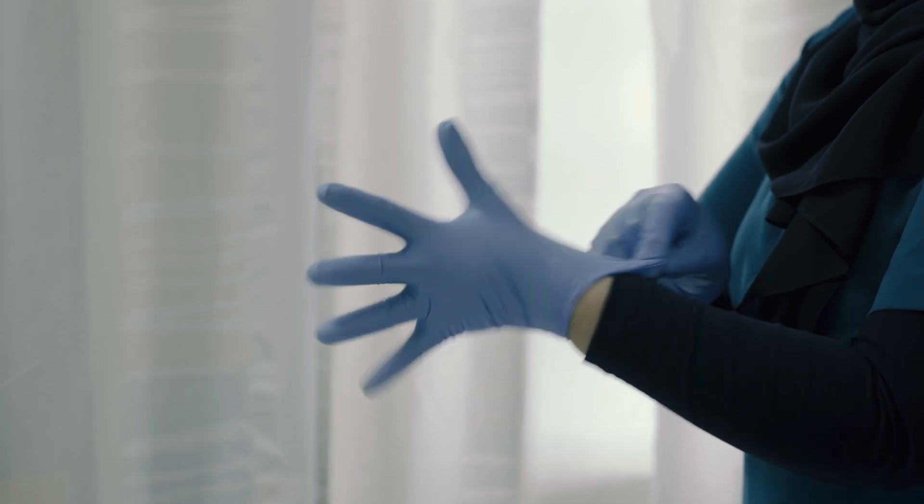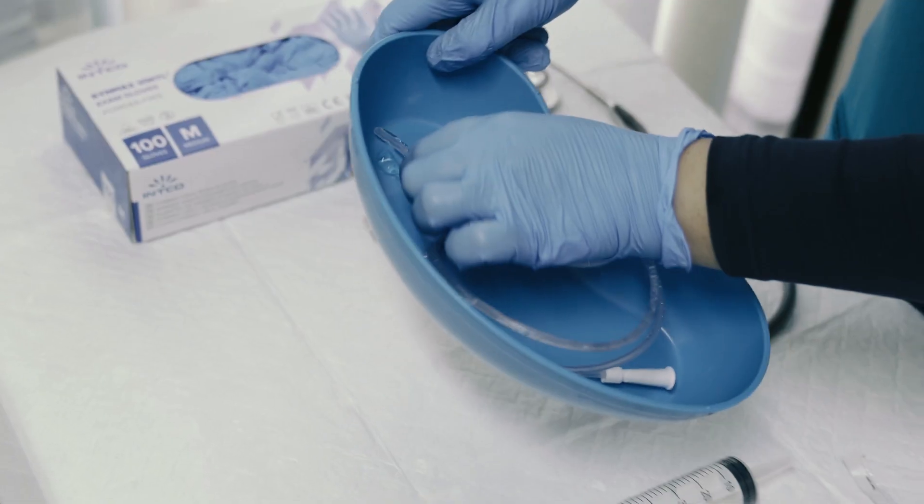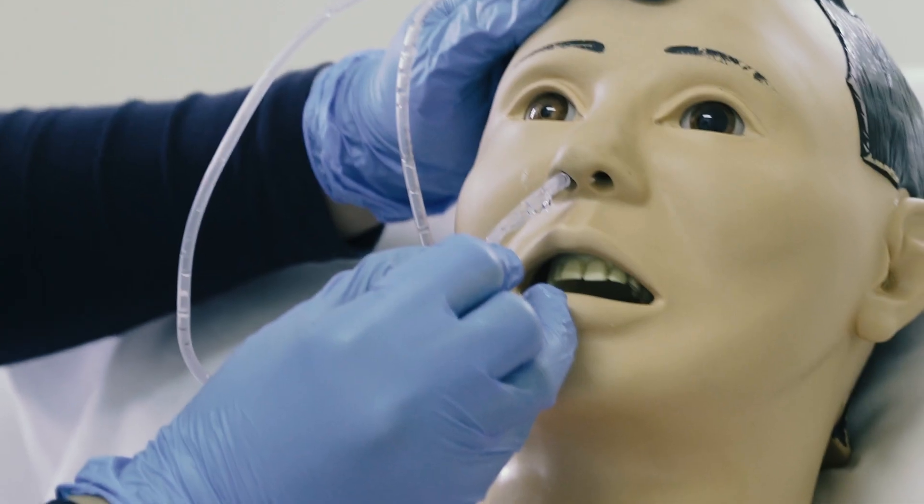Hand rub. Make the adhesive tape ready. Put on gloves. The NGT tube will be lubricated using KY gel.